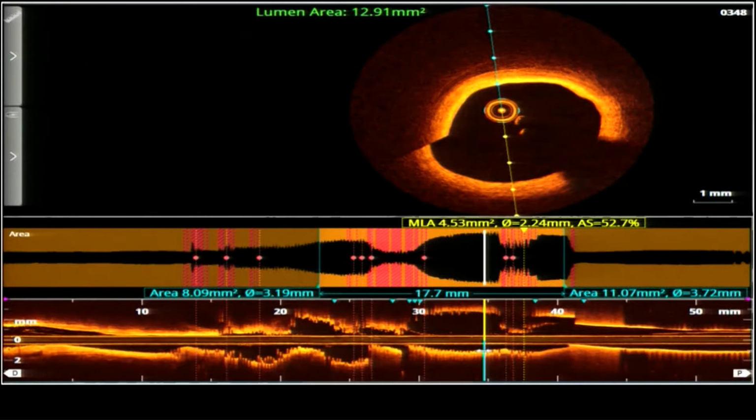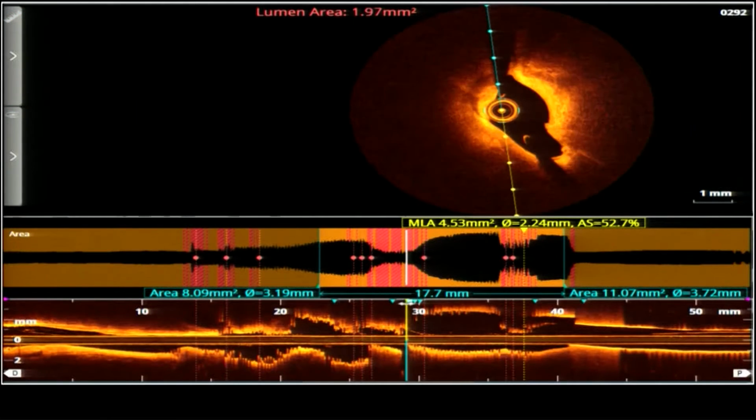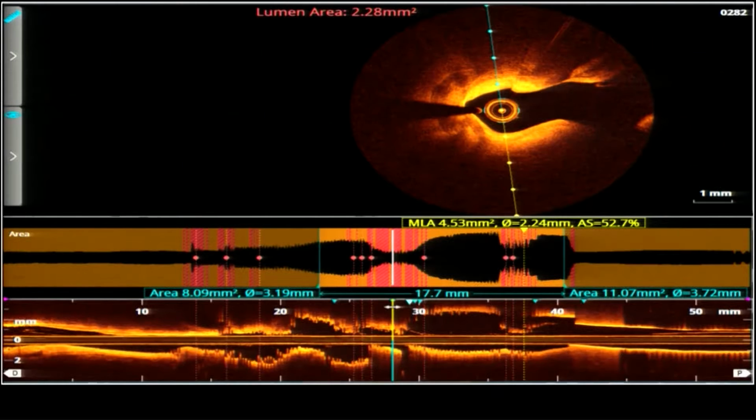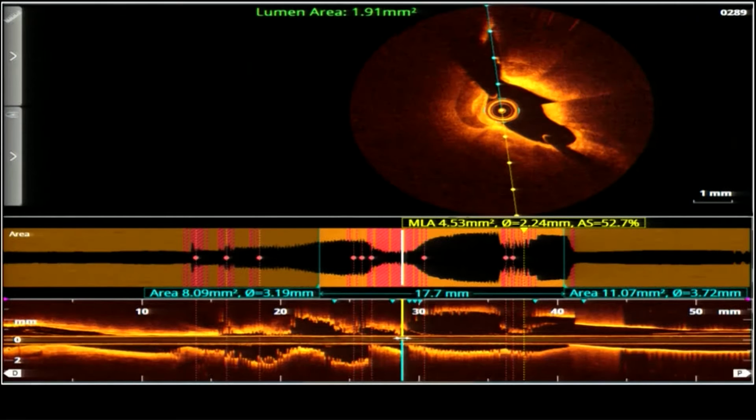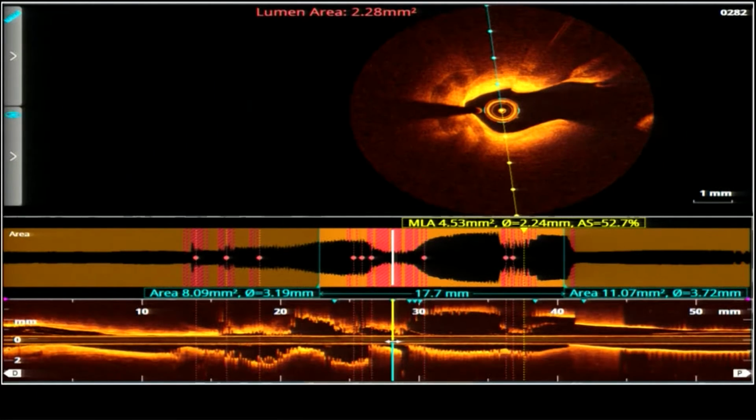With that we have confirmed that the ostium of the LAD is also significantly diseased. Now, can you show the LAD diagonal, LAD circumflex bifurcation? Go to the point, rotate the OCT if you can. Yeah, this is the left main. I think you should still go distally. Come back slightly. This is the tight lesion. Come back, go a little bit down. This is the circumflex ostium.